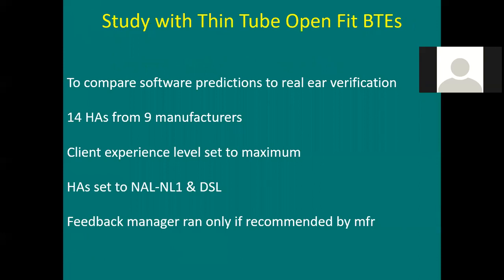I'll finish with this. These are just a couple of cautions. And by the way, what should you do about that? Not a lot. You know what you can do? Your real ear systems allow various ways to get around it. The one way I talked about was using that equalized response, by turning off your hearing aid and then allowing the room to be balanced or whatever with the sound leaking out of the hearing aid.